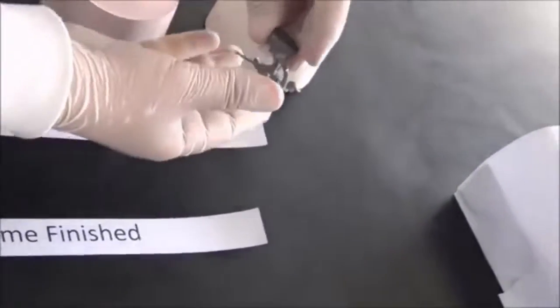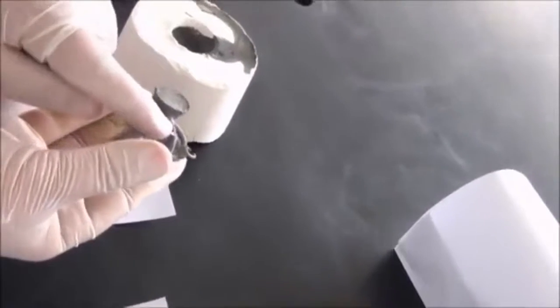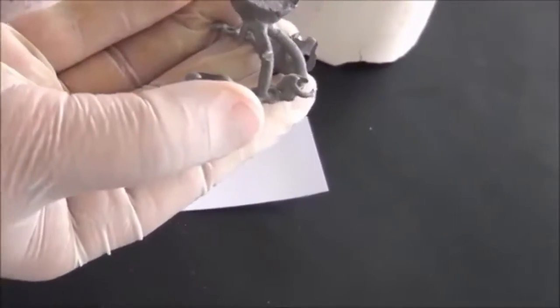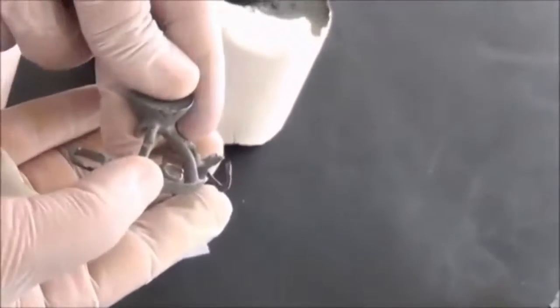So see how the metal took the shape of the funnel, the sprues, and the metal framework that was made previously in wax. To finish this off, remember that these are not components that I'm going to place inside the patient's mouth, so we need to cut them off.